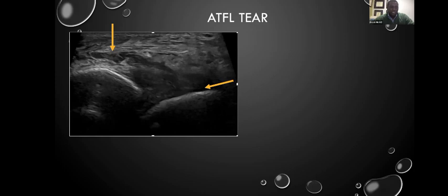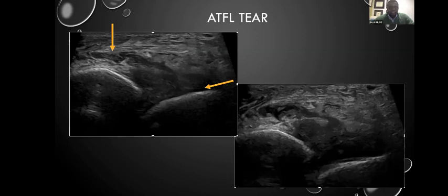Whenever you're looking at ultrasound, I try to identify tears of tendons and ligaments. I do the same thing that we do on MRI, which is look for movement of fluid. So in this case, we're seeing a lot of fluid moving deep to the ligament, but then we actually even see fluid moving more superficial to the ligament. And so here are the images with and without plantar flexion. We're seeing more fluid on the outside of the ligament, and that's concerning.